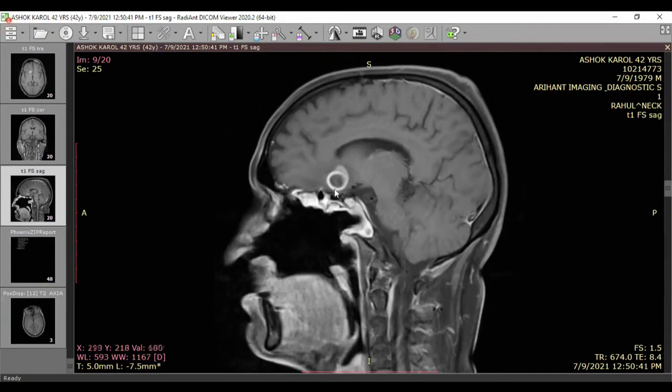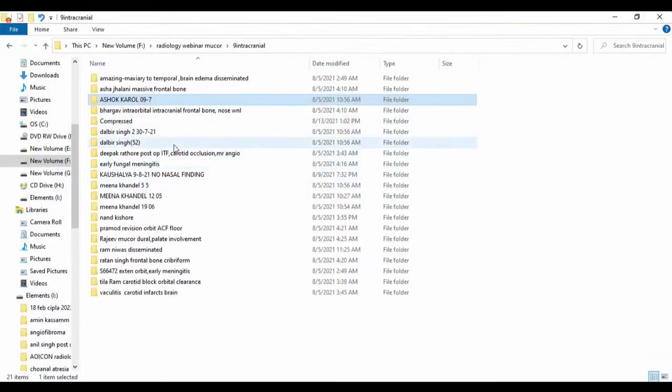These abscesses form when you find endoscopically that the cribriform is necrosed. That means you have to remove it, as otherwise this is going to lead to ascending infection above the layer.